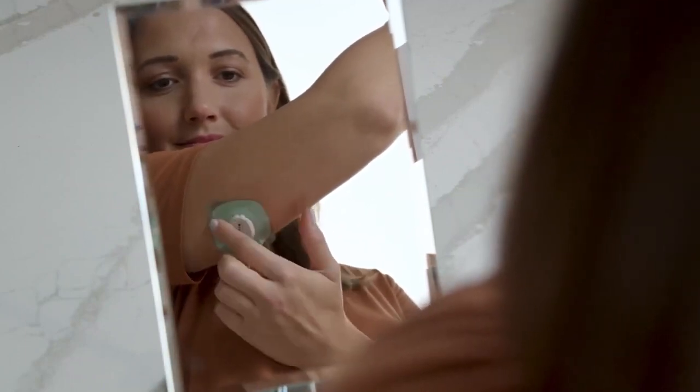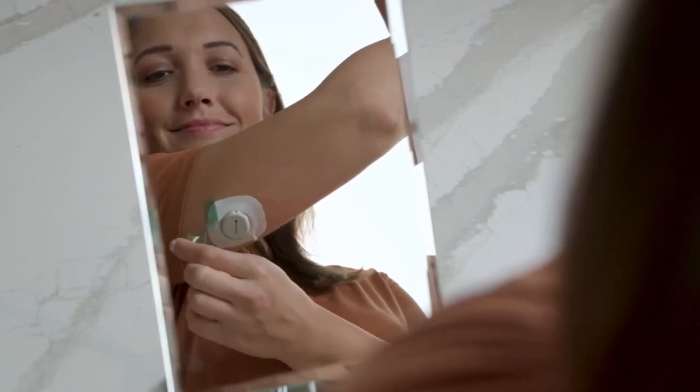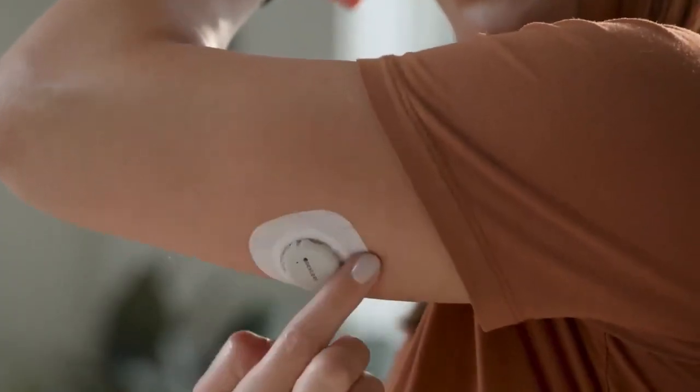You may need to look in a mirror for this part. Rub around the overpatch. Use the tab to peel off the colored liner. Then rub around the overpatch.